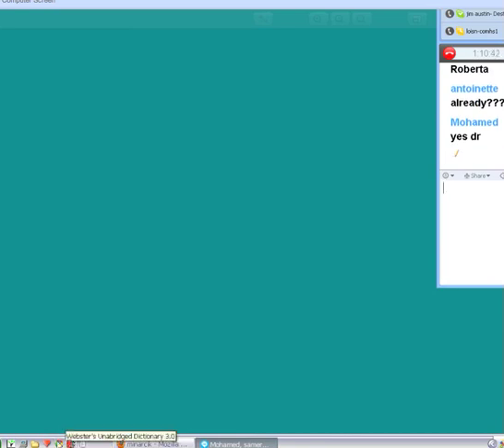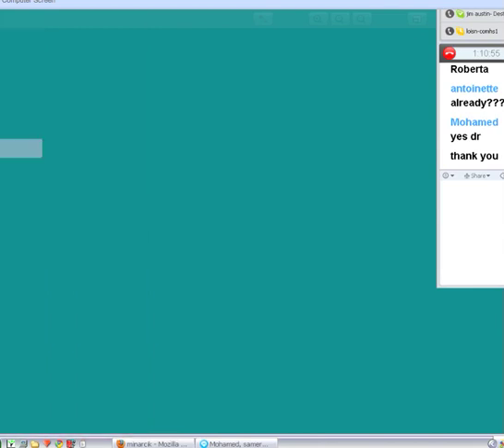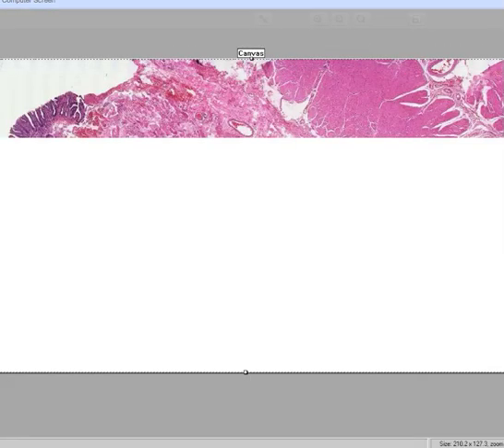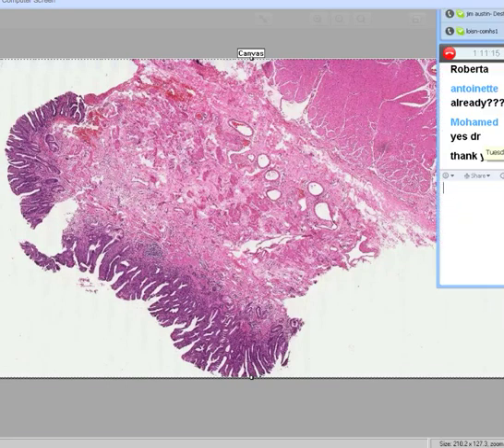Let's do some more cases today. We were kind of on a roll, and it seems like everybody was seeing and hearing pretty well. So I want to finish off on a few GI cases, and then I want to go to a couple liver and pancreas. And as long as everything is still working well, let's rock and roll. The next case I want to show is 4393. And you'll probably all see it in a few seconds, I think.